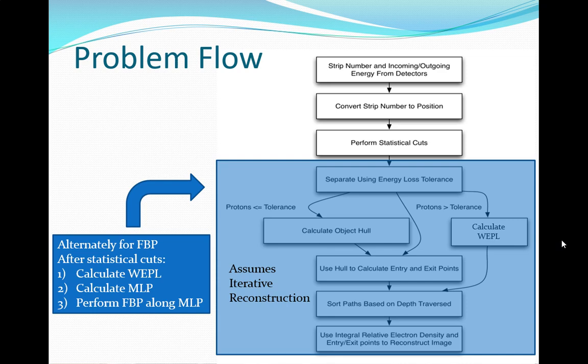We really only want a few degrees of change. We're willing to take more energy, we're willing to take less angle. Because in general, if it's moving fast enough, you should be fine. If the energy has dropped really low when it exits, but the angle is still fairly reasonable, then it passed through safely. So there's a little bit of an interchange on that. But in general, that's what we do statistically.